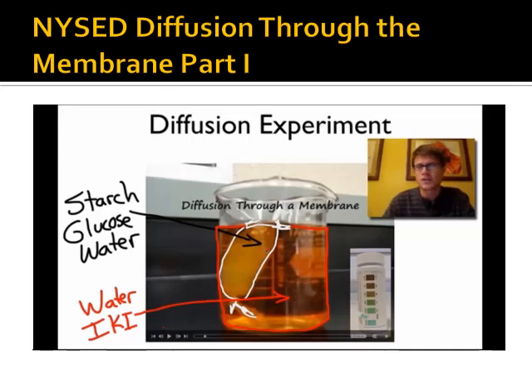Alright. The other thing you normally do before you start this is you start looking at the presence of glucose or the absence of glucose. And so you do that using these glucose test strips right over here. They're used to monitor glucose levels. So if you're a diabetic, it's a good way to see how much glucose there is in your urine, because if you have high glucose levels, it's an indicator of problems with regulating blood sugar. And so what you do is you put a strip into the fluid, and then it will change to a color. So it'll start as a blue color, but it can move all the way up to a red color. And this is what I use in class to figure out if there's glucose present.